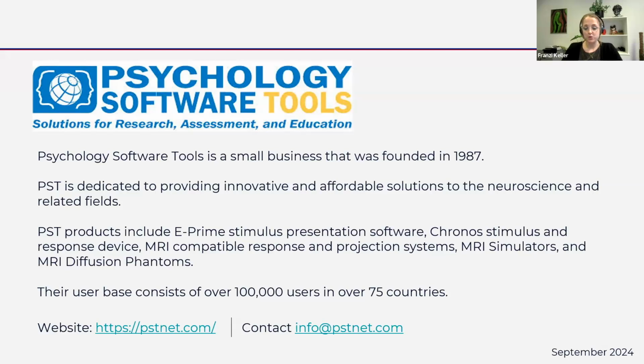The most well-known products include ePrime stimulus presentation software and the Chronos response device, both of which I've had the pleasure of working with myself as well. Also MR-compatible response and projection systems, MRI simulators, and MRI diffusion phantoms. They have a user base of over 100,000 users in over 75 countries, and you can find them on the web, of course, and contact them at the email addresses linked below.